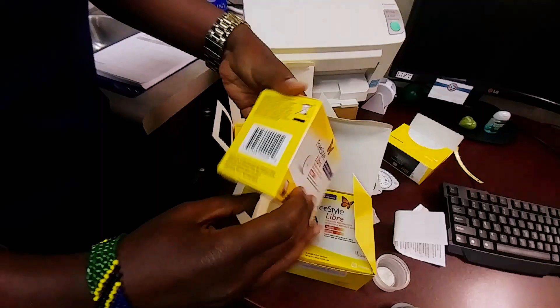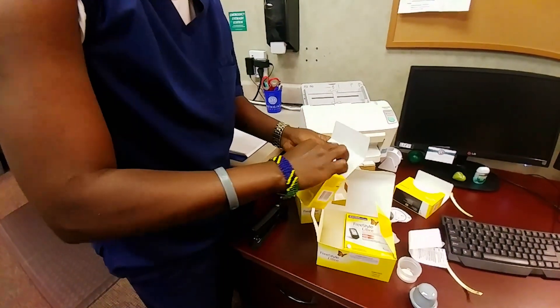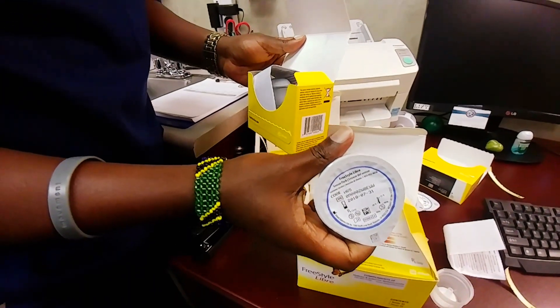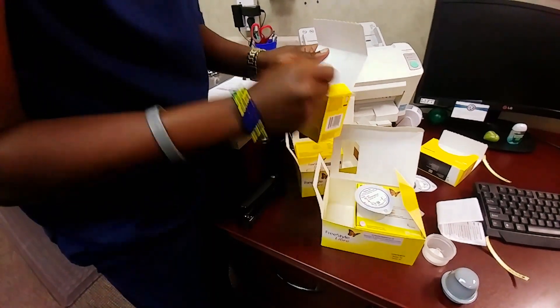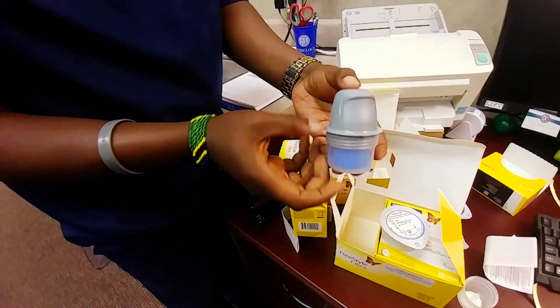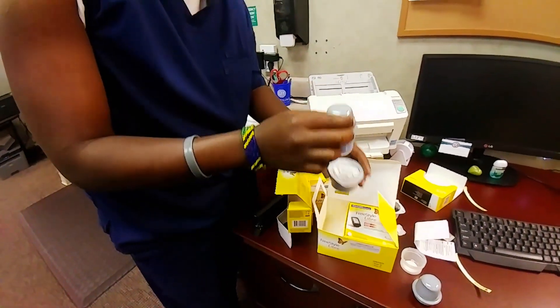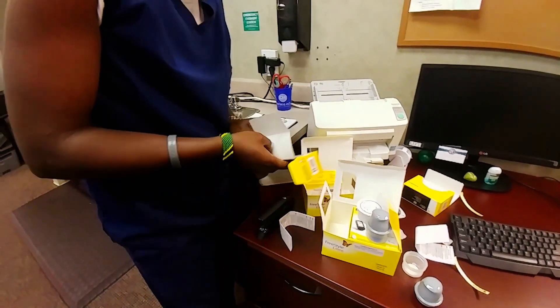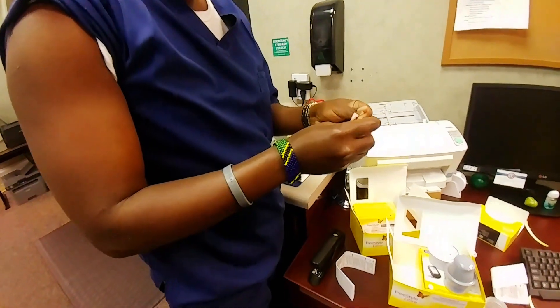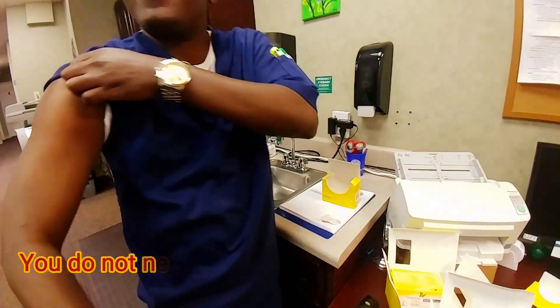Inside that box we've got the sensors, and then the applicator is this thing right here. Pretty soon Sabas is going to show us how to use that. We also have some alcohol that he's going to clean off with. Are you left handed or right handed? Right handed. Okay, so why don't you put it on your other side.